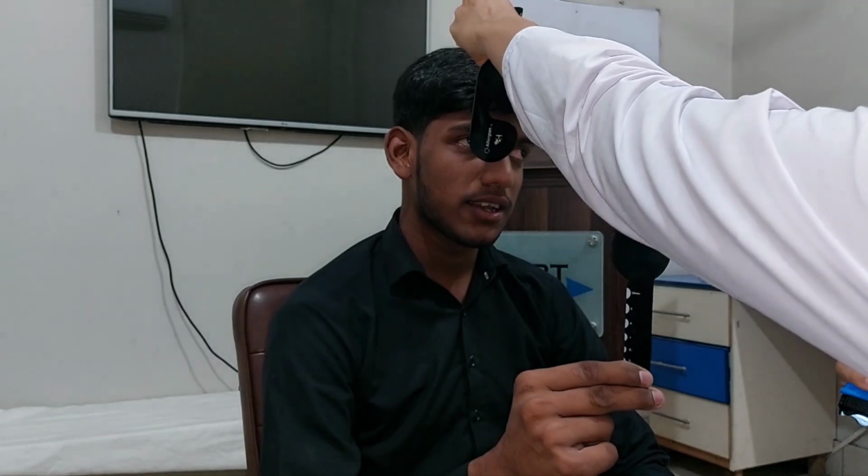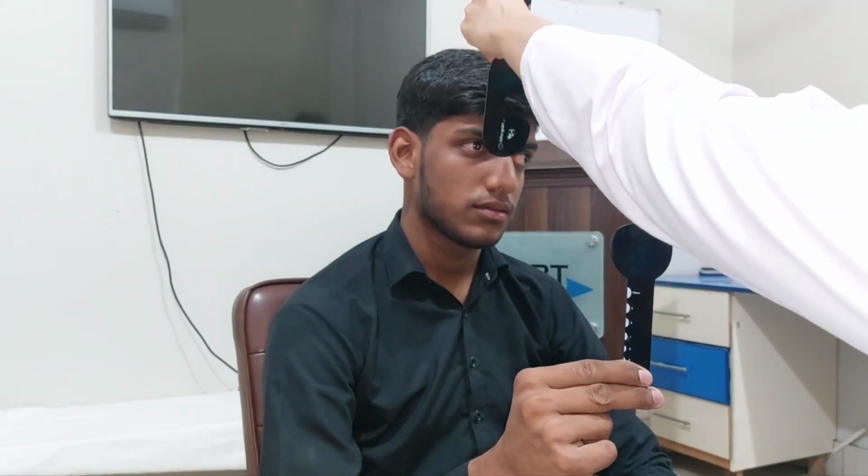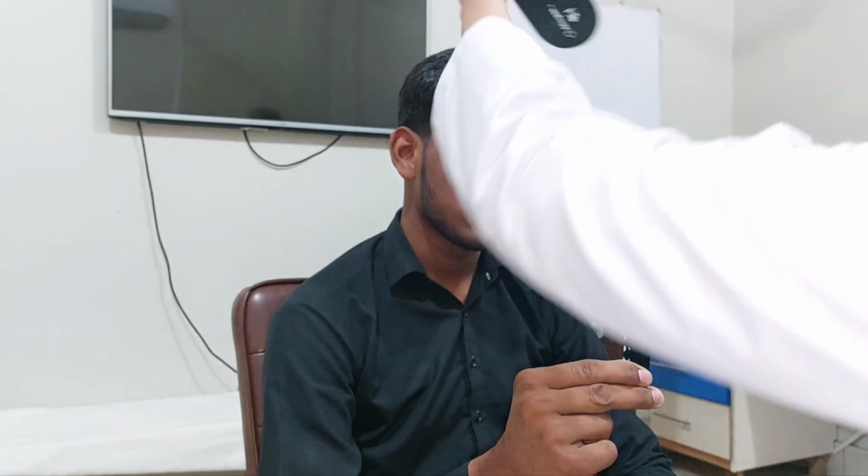Sir, the vision in the non-fixating eye is not enough for the patient to fixate. So ideally, this patient should not be subjected to prism alternate cover test. You see, bifoveal fixation is necessary to have a good cover uncover or the prism cover test. So in this patient, sir, we will perform the Krimsky test. In this case, we can perform Krimsky test.